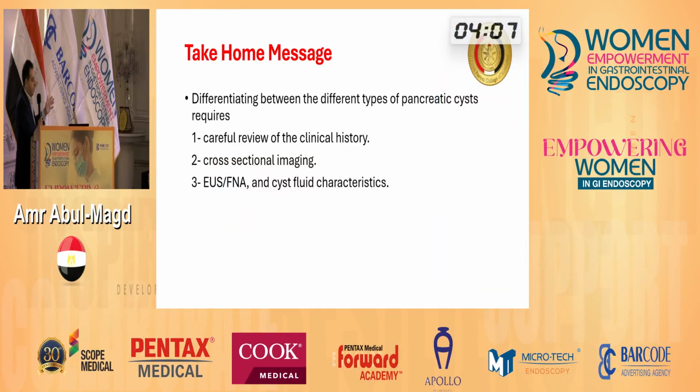Differentiation between different types of pancreatic cyst is required. Careful review of clinical history and cross-sectional imaging may be helpful, but always trust your needle and cystic fluid analysis.